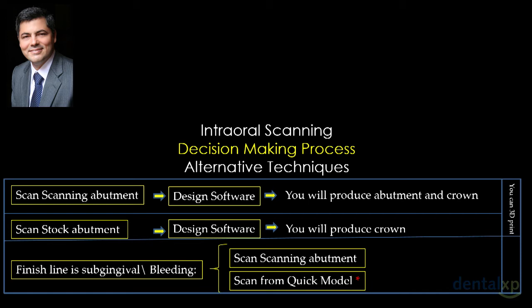So I believe in abutments when you're using more complex, more powerful milling machines to make the abutments. But I don't have a problem with the crowns. I think that the available technologies for making crowns today work great. For abutments, I'm a little bit more hesitant. Now, the second option is when we are placing on that implant that we had just surgically placed on that patient, when you're placing a stock abutment.